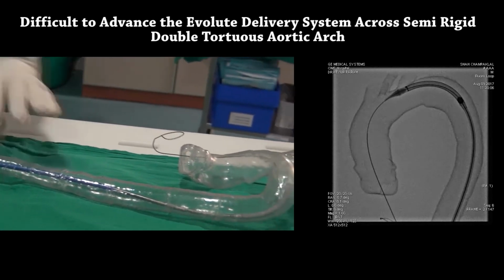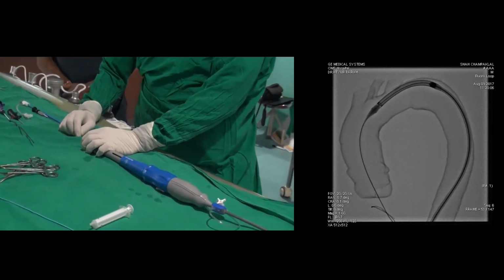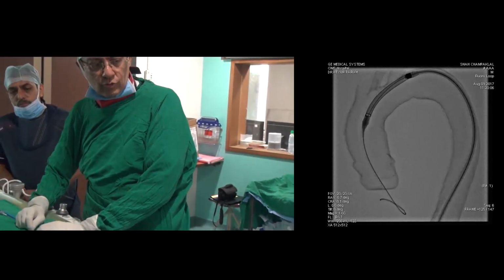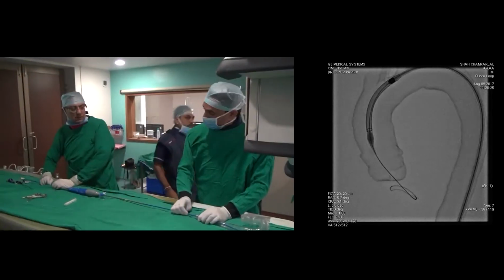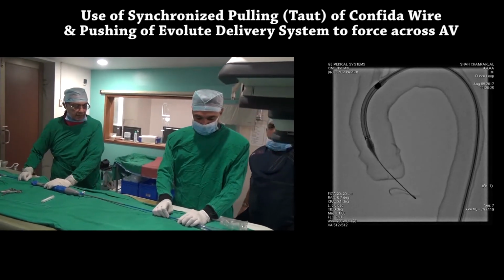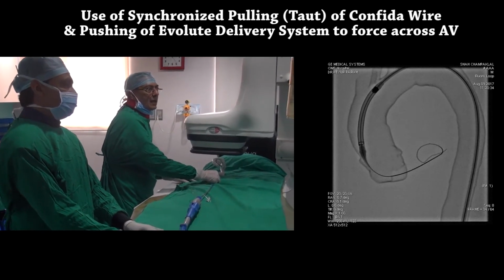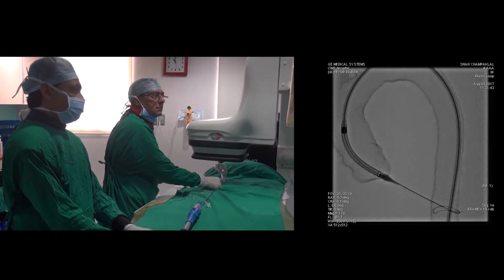No doubt this arch was semi-rigid, whereas the human aorta is more flexible, but in the 84-year-old patient, we felt that there will be some degree of rigidity. So we tried and we found that using a synchronized pulling of Confida wire and pushing of the Evolut delivery system helped us smoothly go across the aortic arch as seen on the right side in the fluoroscopy image.